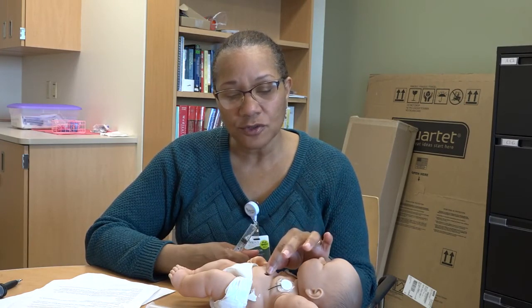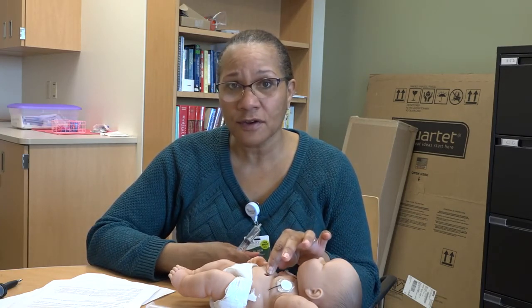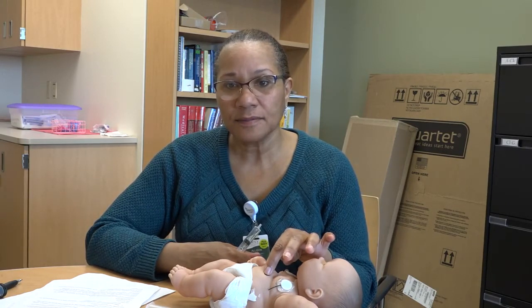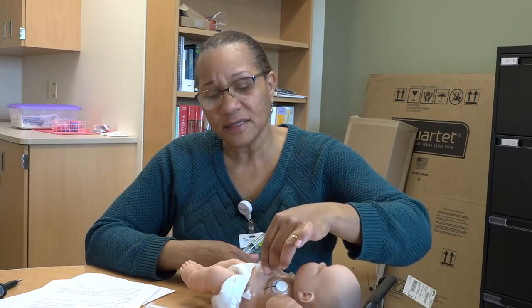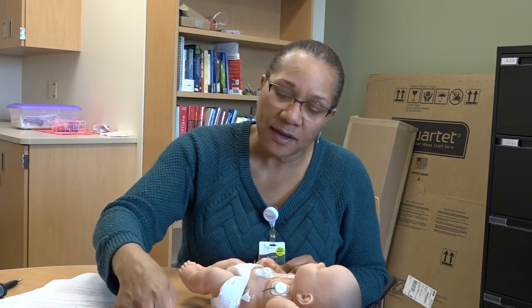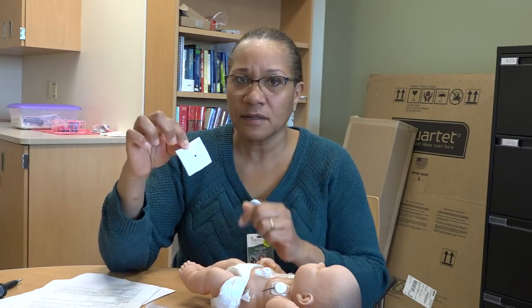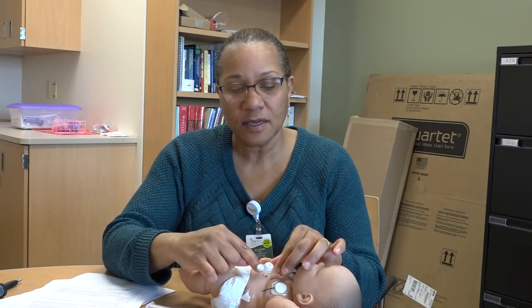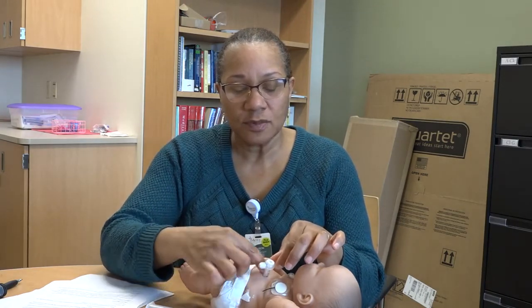So with that new tissue that is growing there and a new blood supply that is growing there to bring nutrition to that new tissue, this tissue is very vascular, and if the tube happens to bump up against that granulation tissue, it can cause a little amount of bleeding. So sometimes what families notice first is a little bit of blood on the 2x2, or they are noticing that there's a pink budding type tissue coming around the G-tube site itself.